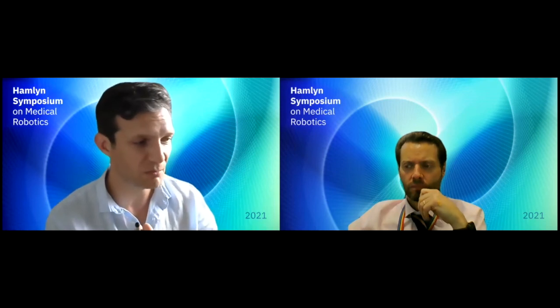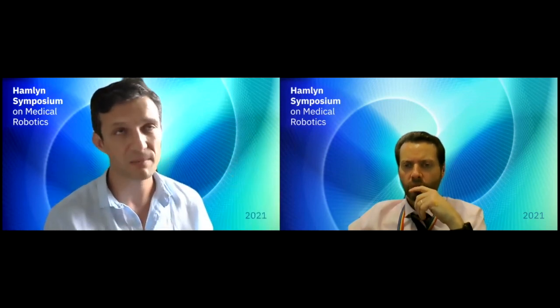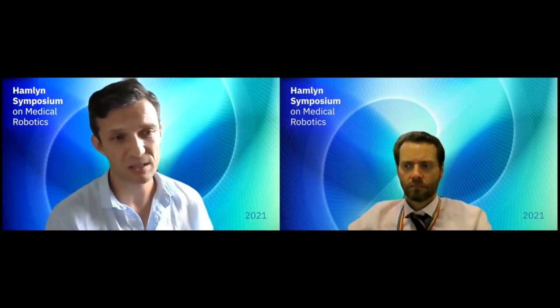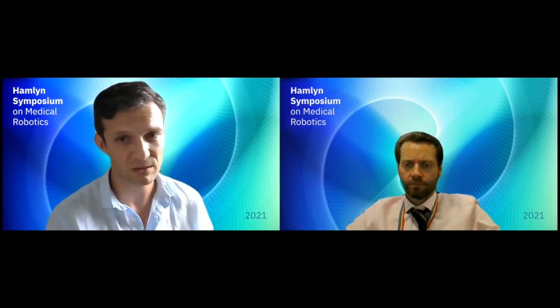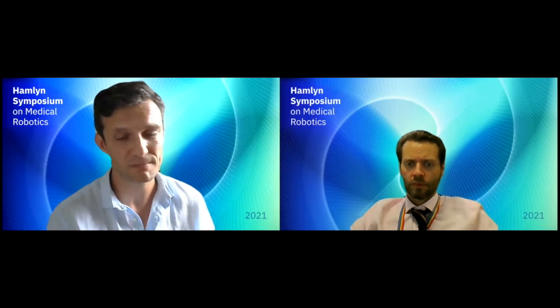I mean, there isn't really sufficient data at the moment to really understand the behavior and how this data transfers between the different datasets. But the indication is, and what we were excited to see, was that actually you can avoid supervision on the disparity. So you can avoid the 3D supervision and still get decent results. So I think that was an exciting finding that we're hoping to present.